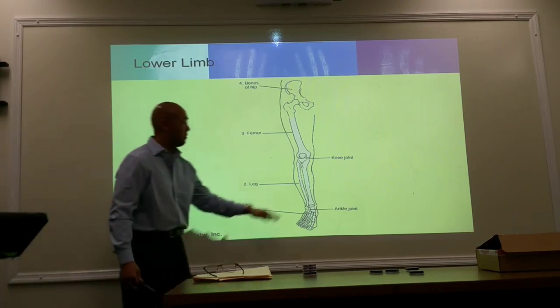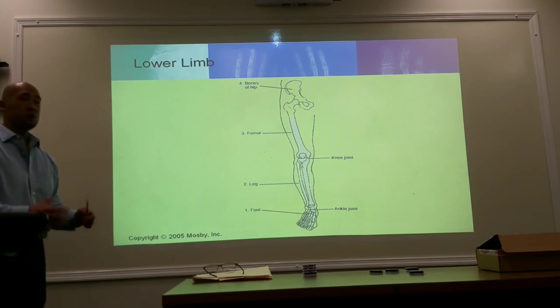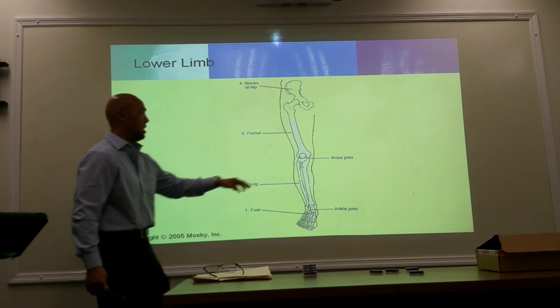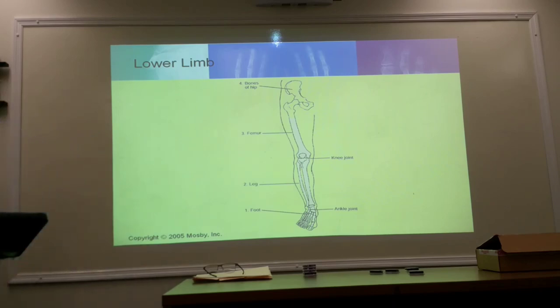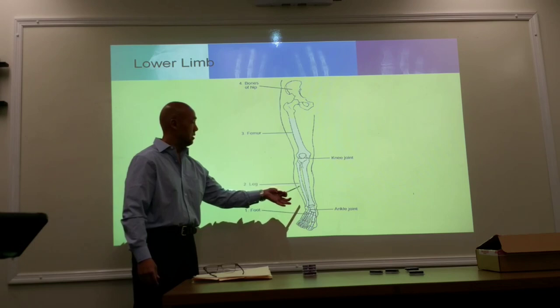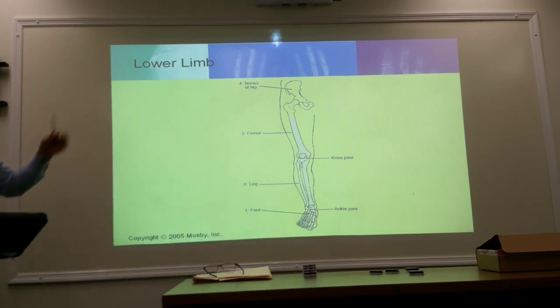Same thing here: most of this is going to be done tabletop because we're talking about anatomy that's less than 10 centimeters, and as you approach the knee, now we're going to start using grid or the table bucky. Okay? All right, so here we have the lower limb. We've got the foot, the ankle joint, the lower leg, which is your two bones, tibia, fibula, knee, femur, and then we'll talk about the bones of the hip later on.